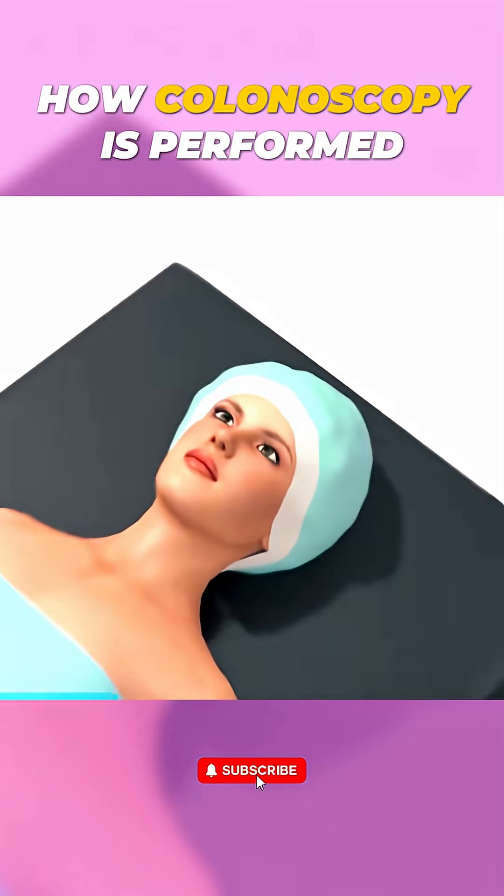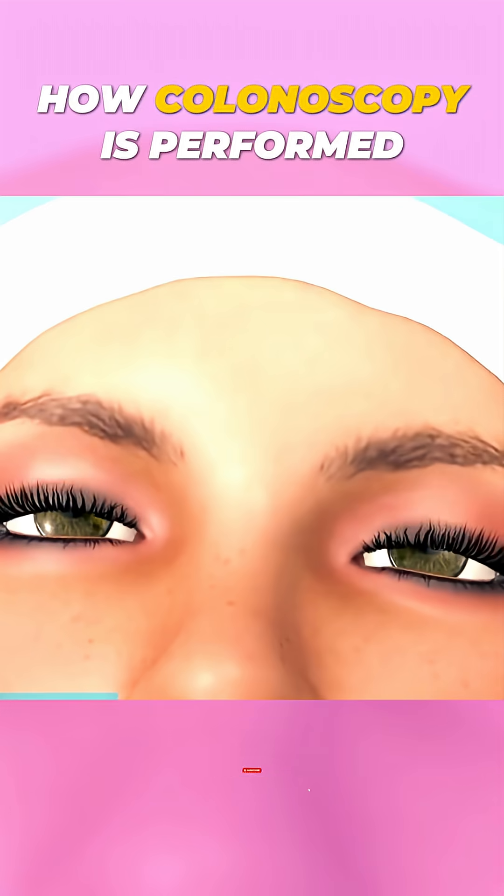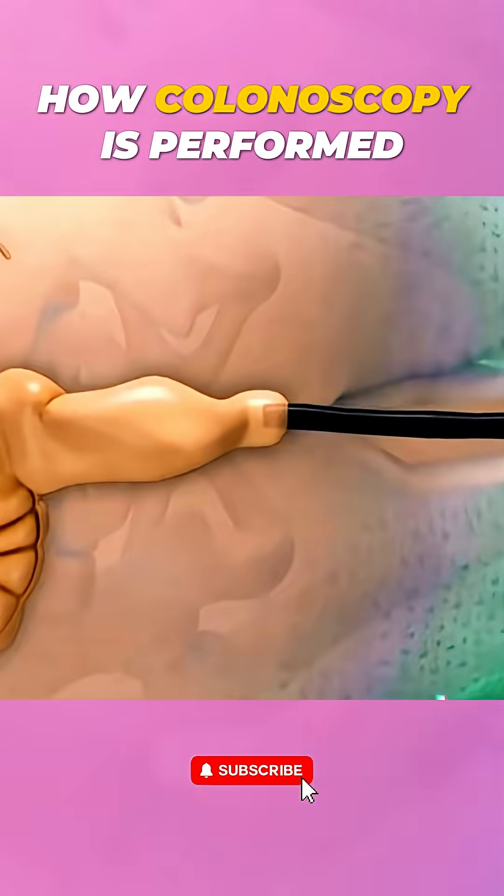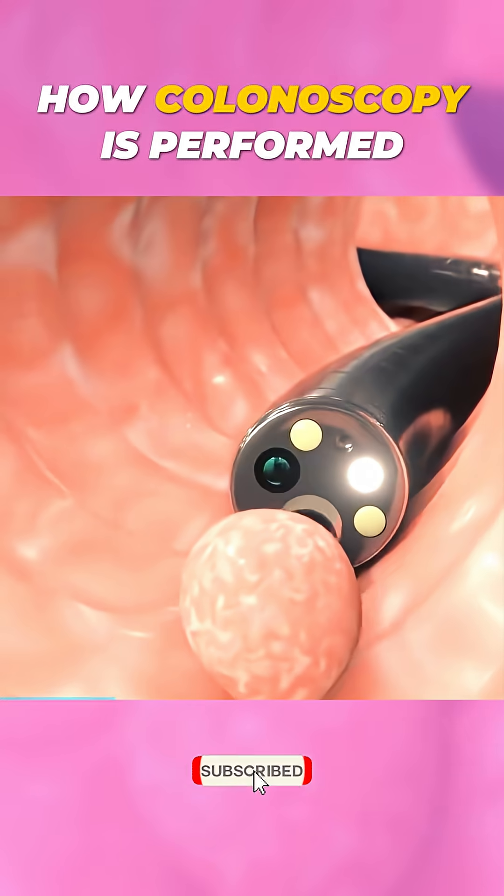During the procedure, the patient is usually sedated to stay comfortable and relaxed. The colonoscope is gently inserted through the rectum and carefully guided through the entire colon.